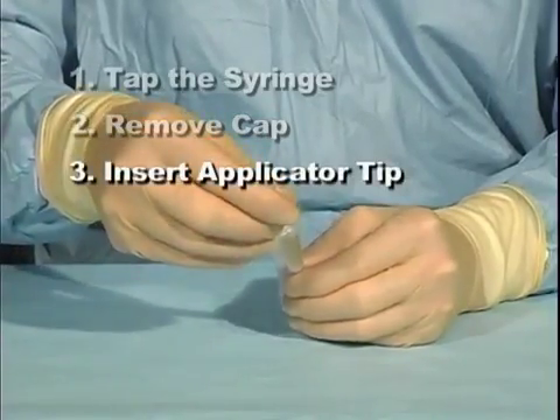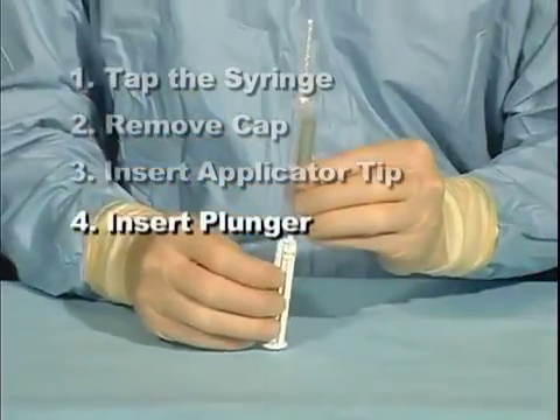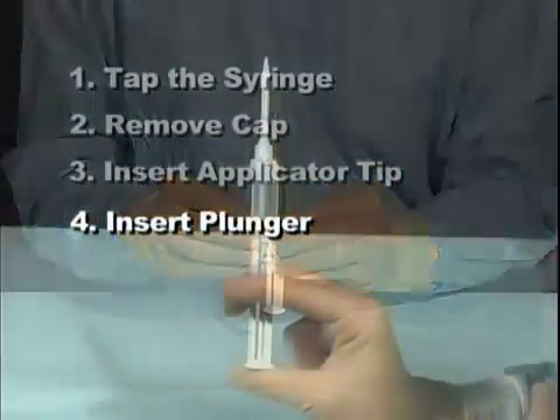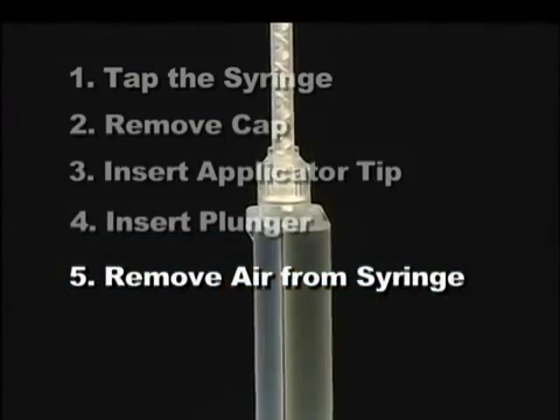Insert the applicator tip and lock it into place. Insert the plunger into the bottom of the syringe until resistance is felt. Remove the air from the syringe using one of the two methods previously outlined in this video.